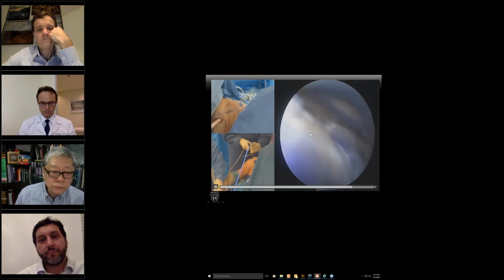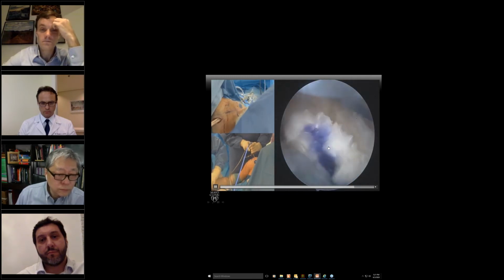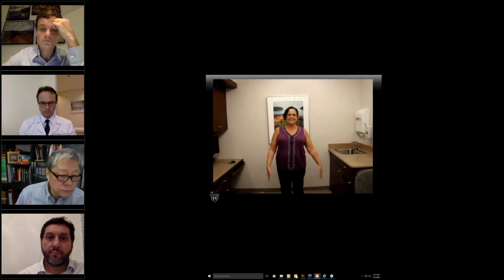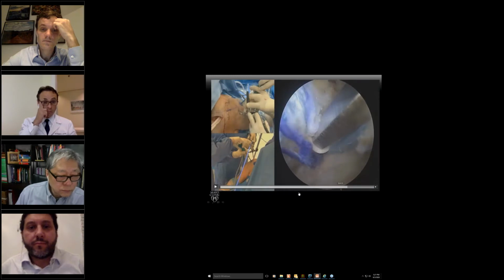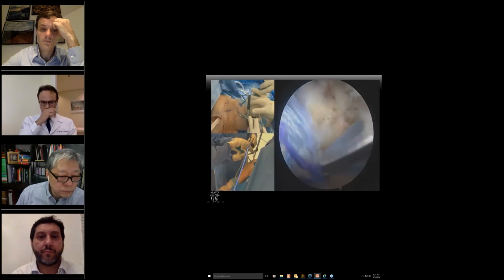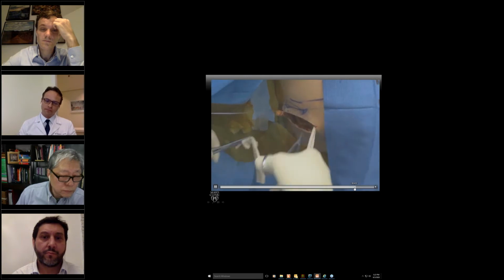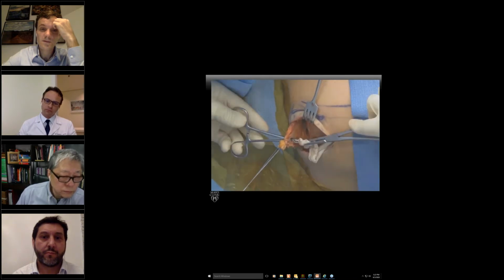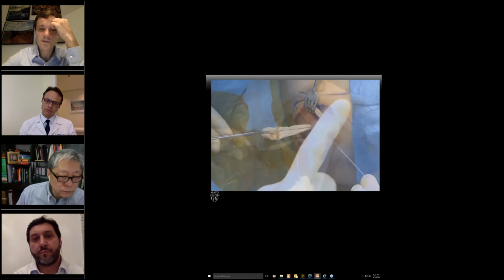And you can see now we can pull on the tendon if you want to tension it. And here we position the shoulder in posterior superior. I always put them in abduction. This is very important because I get asked this question all the time. I put them in this position when I tension it, because this will shorten the distance of the Achilles tendon, and I place enough tension on the tendon to repair.